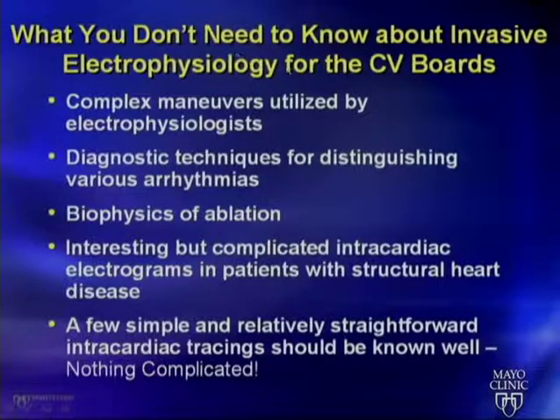You don't need to know anything complicated. So there are no complex maneuvers, biophysics of ablation, nothing complicated in terms of intracardiac tracing. So we'll keep it simple. And pretty much what I'm going to talk about over the next 5 minutes will be really all you need to know in terms of the boards.